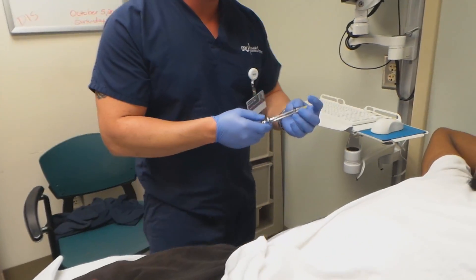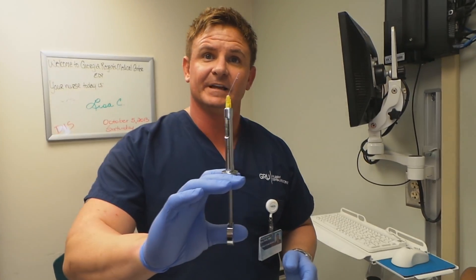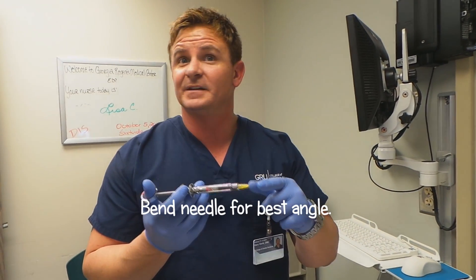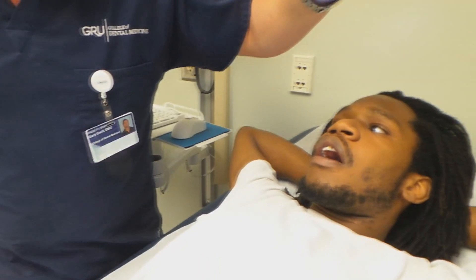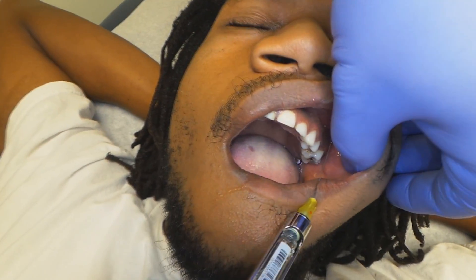What I'm going to give him is an MSA, because that's where the tooth is broken. You can bend the needle slightly just to get the right angle — not too far. I'm only bending it because I'm not burying the needle to the hub, just in case it does break off, so I can still grab and pull it out. See where his tooth is broken? That's actually his second premolar — that's where you want to block the MSA. The buccal vestibule is right there.